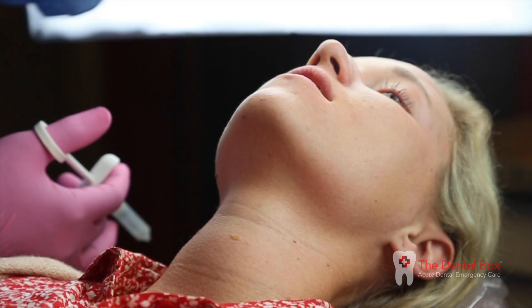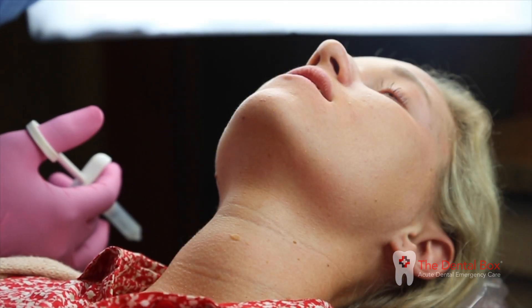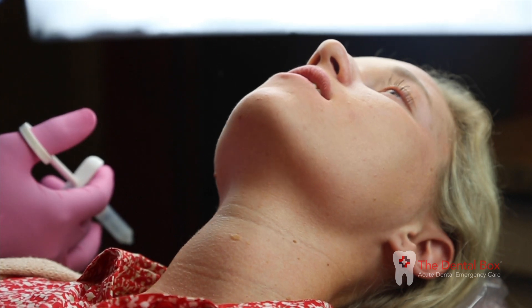Position patient supine if possible. Have patient open wide and extend neck, with their chin towards the ceiling.